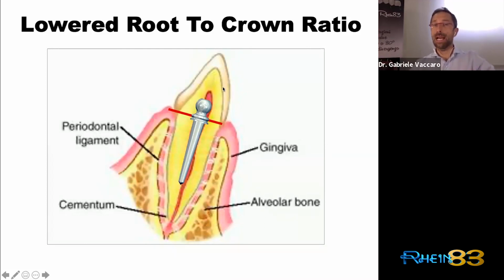If we use a traditional clamp, our forces would always be centered in the crown, giving a big lever for the periodontal ligament. And it can create a periodontal ligament enlargement and the loss of the tooth at the end.